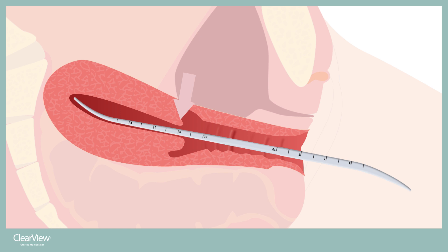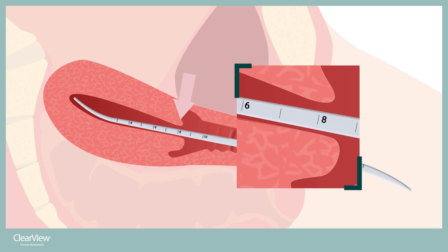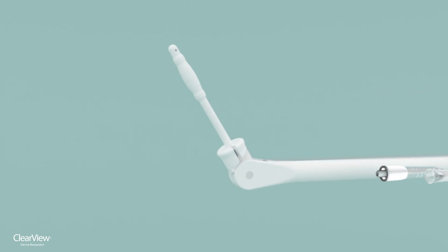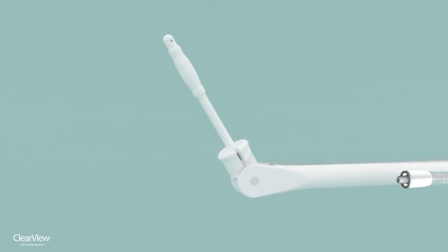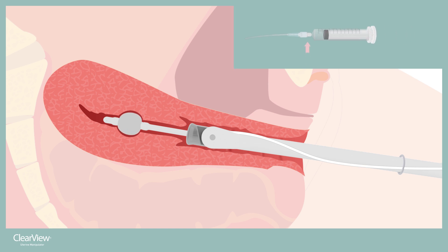The appropriate length manipulator is selected according to the depth of the uterus. The manipulator tip should be positioned one centimeter below the maximum sounded depth of the uterus — meaning in this case we would use the ClearView with the seven centimeter tip. The small soft elastomeric tip makes it easy to insert and reduces the risk of uterine perforation, while eliminating the need for a tenaculum.